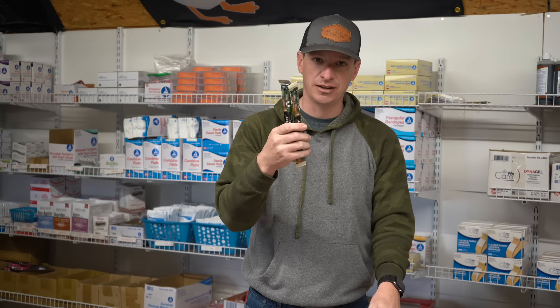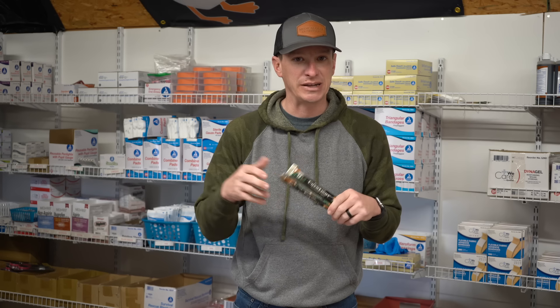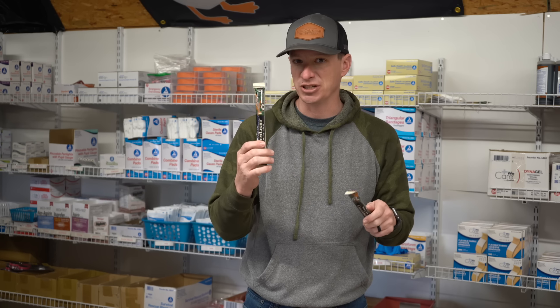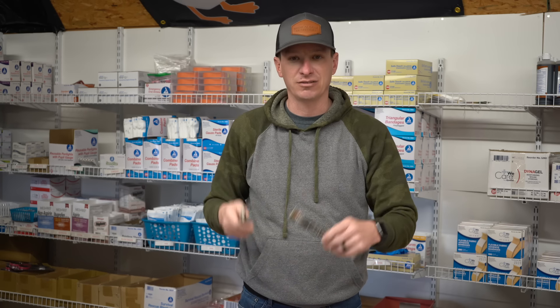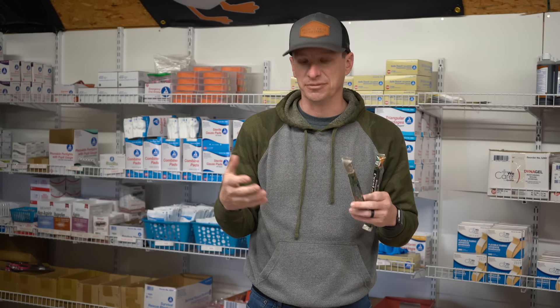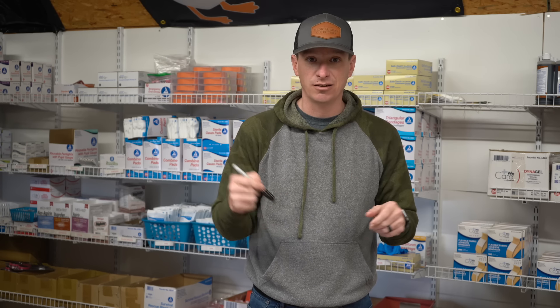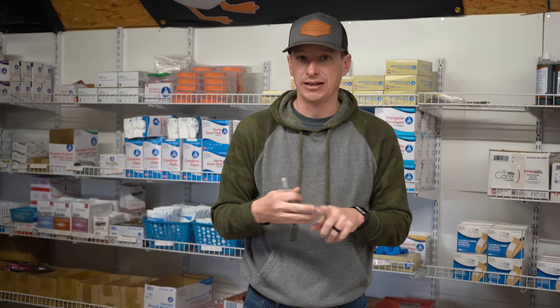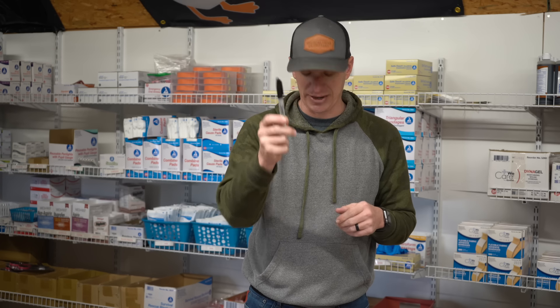I like having chem lights in there to break open so you can see what you're doing, especially after dark or in dark places. Pop them, hang them in a tree, hang them on the side of a car, lay them on the ground — they help you see, and you can work hands-free. I also like having a Sharpie in my kit to write things down — phone numbers for the patient, who to contact, allergies, or the time I put the tourniquet on. Plenty of reasons to carry a Sharpie, and it's a cheap add.